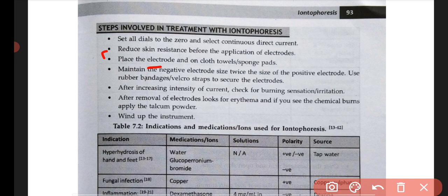Place the electrode on a cloth, towel or sponge pad. Maintain the negative electrode size twice the size of the positive electrode. Use a rubber bandage or Velcro strap to secure the electrode.